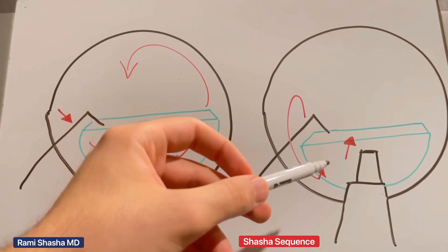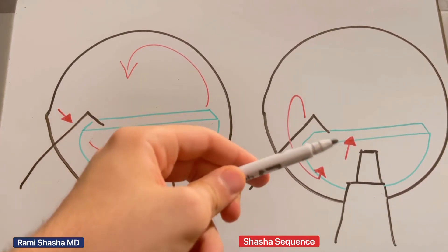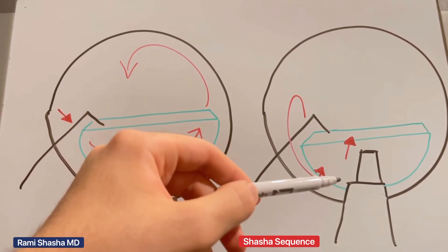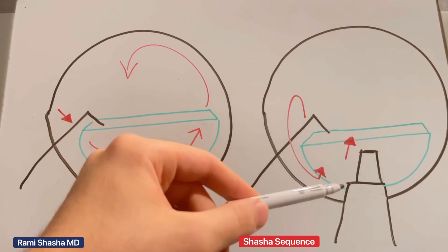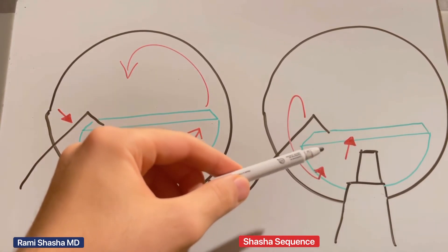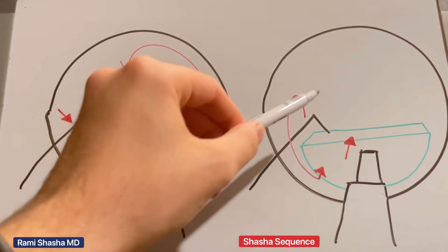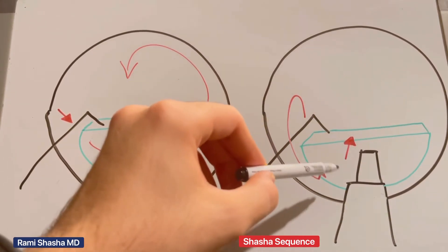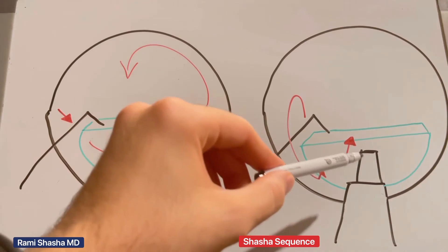Often when there's a non-rotating hemi-nucleus, there are adhesions between the endo-nucleus and the epi-nucleus, or there may be weak zonules in that region. In this case, you're mechanically dissecting and staying on position one.